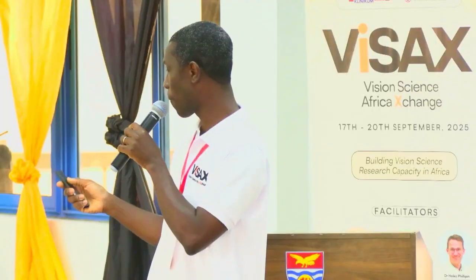If the retina was still there and working, then they might want to take out the vitreous, take out the lens, and then probably fill it and put an IOL in there. So that might be a reason why you might want to do this. The good thing about an ERG in this case is that the opacity makes a nice diffuser. So when you flash light inside, it scatters it all into the retina. If the retina is alive, you'll get a signal. So that is what we can use this for.